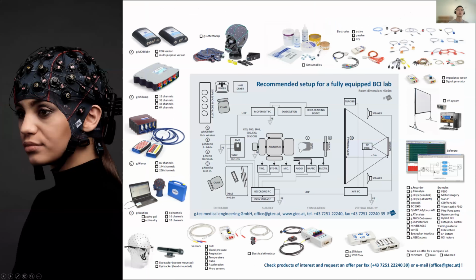So in a general sense, we provide different types of hardware. You can combine with different types of sensors, eye tracker, VR glasses, motion tracker, whatever you call it. As long as we can combine the modules together, then we are doing multi-modal stimulation.